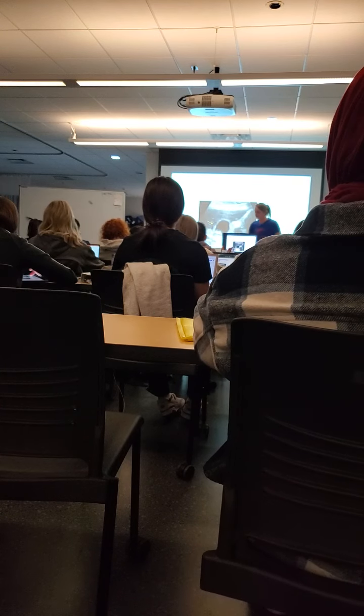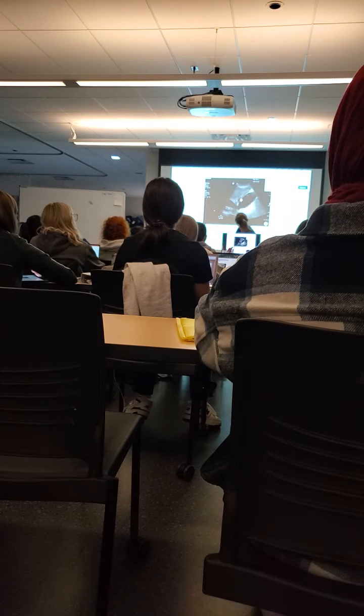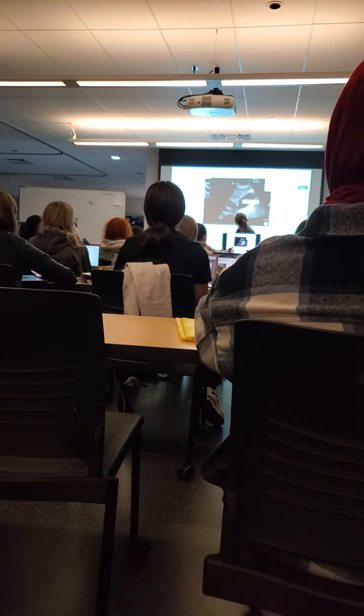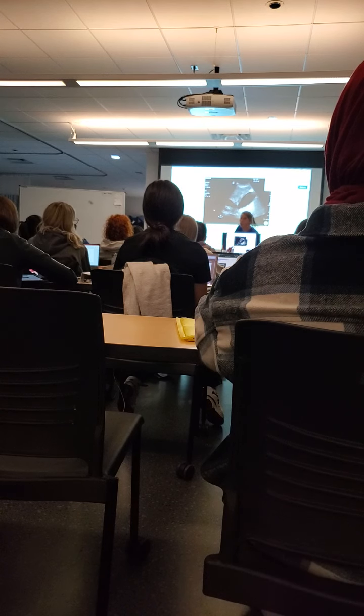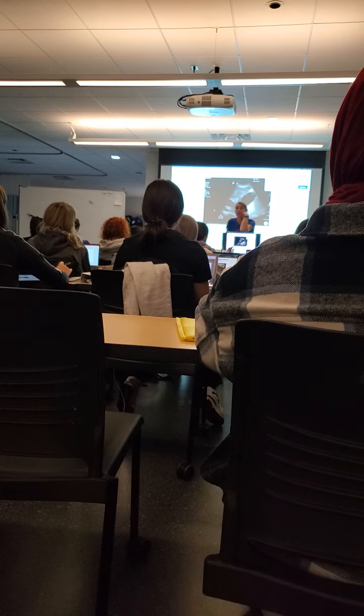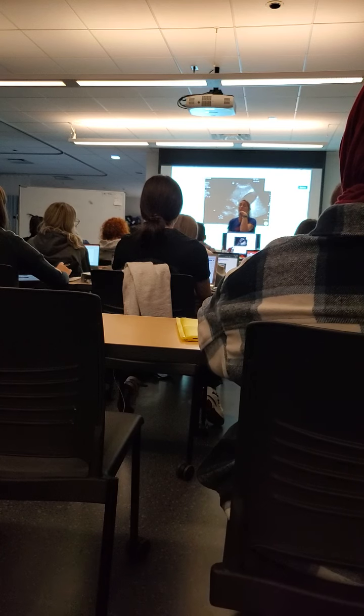All right, oh, this is one here. So this is pericholecystic fluid. You guys see this, like, this little smidgy of fluid in here? So if you squish him too hard, he's going to go away. But there's that pericholecystic fluid. How will we differentiate if it's pericholecystic fluid or rupture of our gallbladder? Ruptured gallbladders look horrifying. And we'll see them.